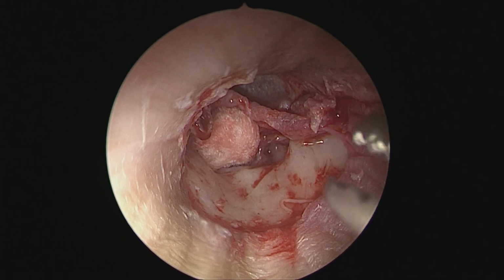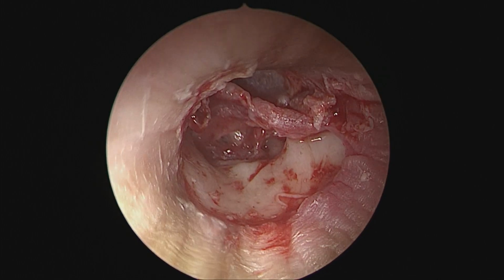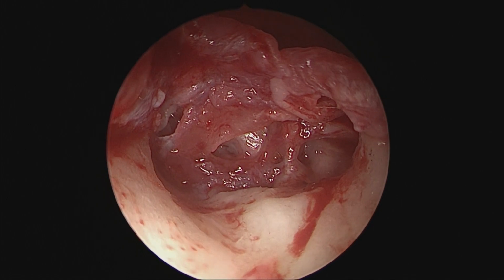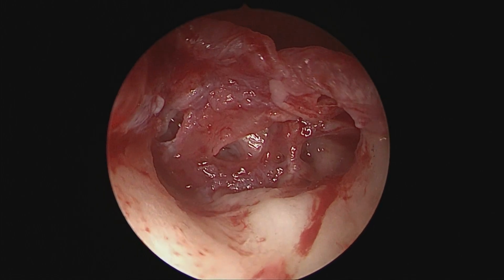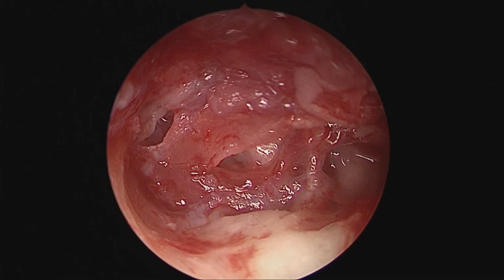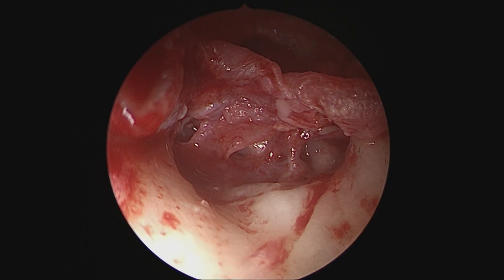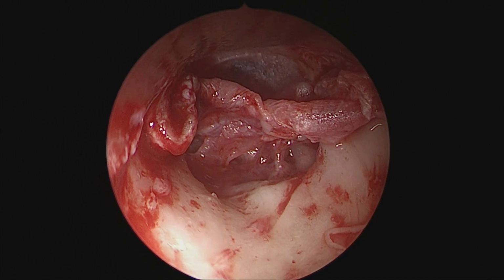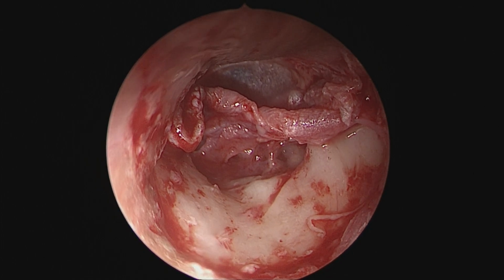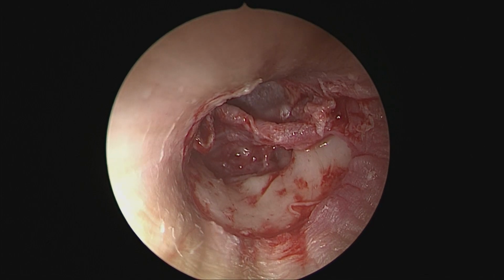So use a little small cotton ball for some temporary hemostasis, as well as to gently elevate the canal skin inferiorly even further. We see that with some hemostasis, we do not see any evidence of any squamous epithelium as yet. What we observe is just granulation tissue and some polypoidal middle ear mucosa. And as you probably see, even this kind of tissue in the absence of squamous epithelium is good enough to cause ossicular erosion.